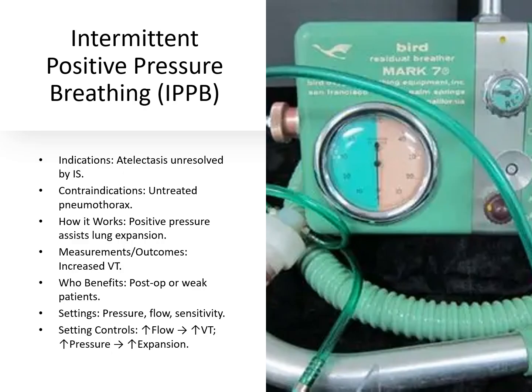It benefits post-operative patients or those with muscle weakness. Settings include pressure, flow, and sensitivity. Increasing flow increases tidal volume, and increasing pressure increases overall expansion.